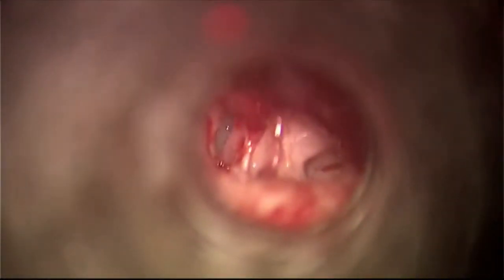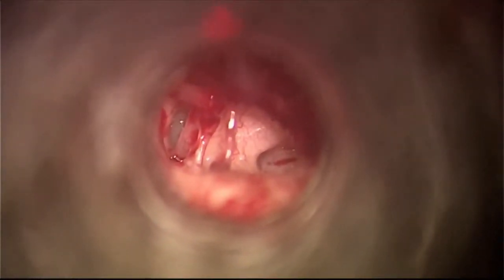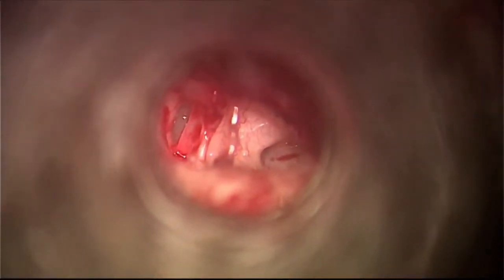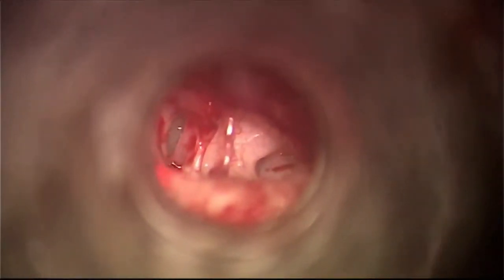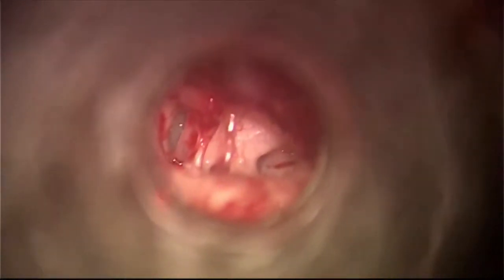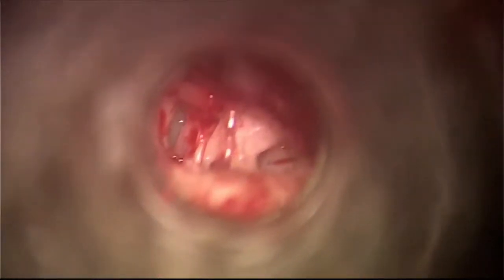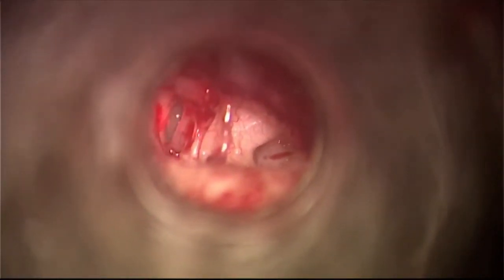Put the picture in the center, a little bit centralized. Yeah, just a minute. So what's the magnification at present? It's a zoom microscope, so it's difficult to say. I can't see from here, because this is a zoom microscope, no? Okay.